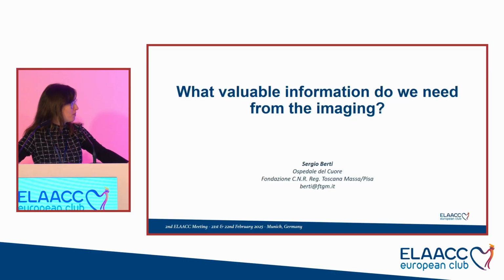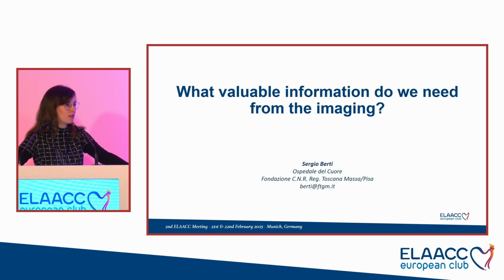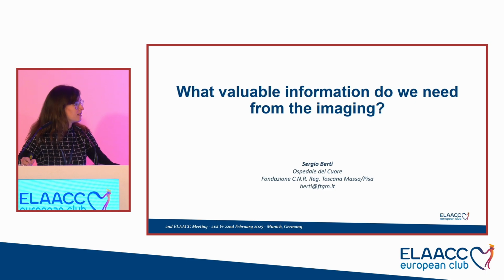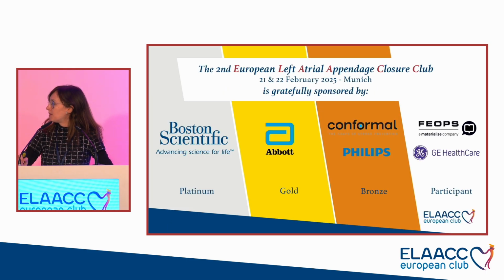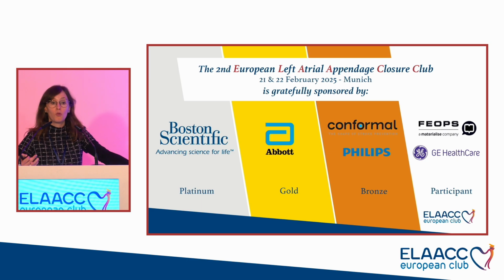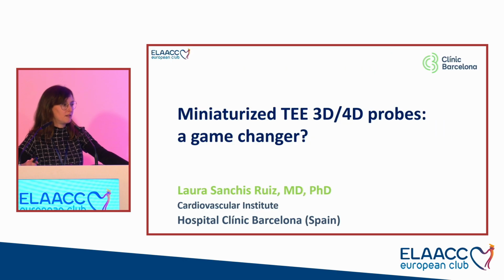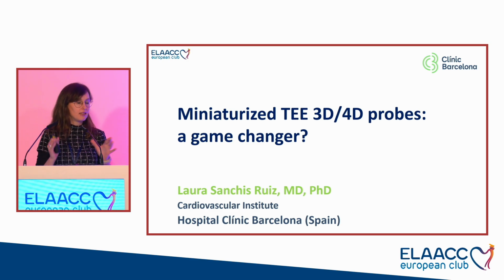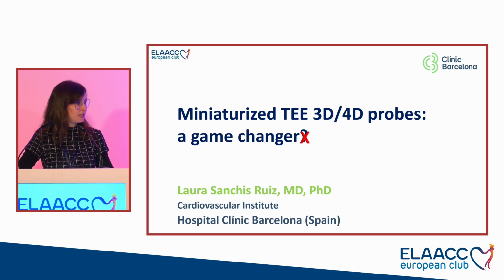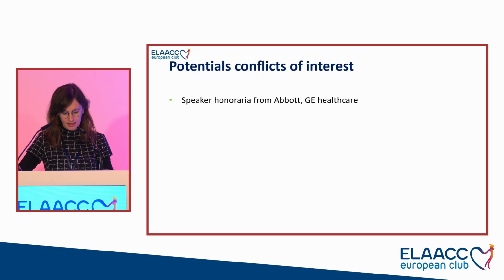So thank you for the introduction, and I really like this topic for my talk because we have now used the mini probe for almost 2 years. And can I have my slides? I think the most important part is not the mini itself. For me, the most important part is the 3D guiding, because we talk a lot about planning and specific programs just to make an approach for the appendages, but then how are we going to close these appendages? I think it's very important to properly guide this closing. So for me, more than a question of whether it's a game changer, it's an affirmation. The mini 3D TEE is a game changer.